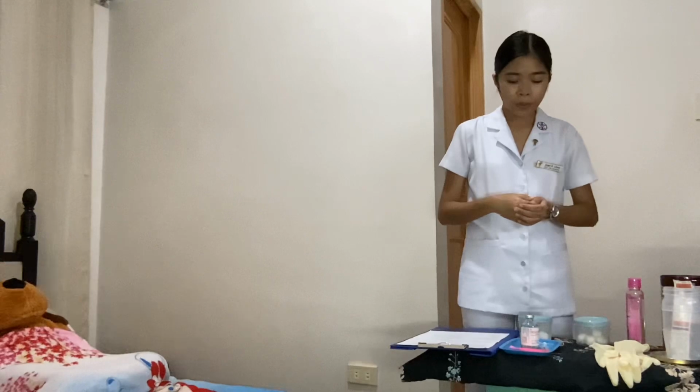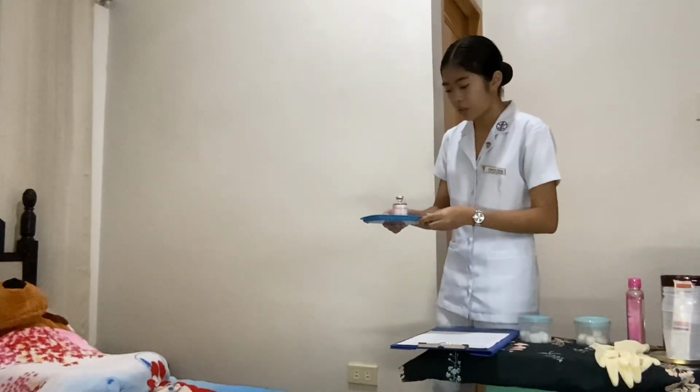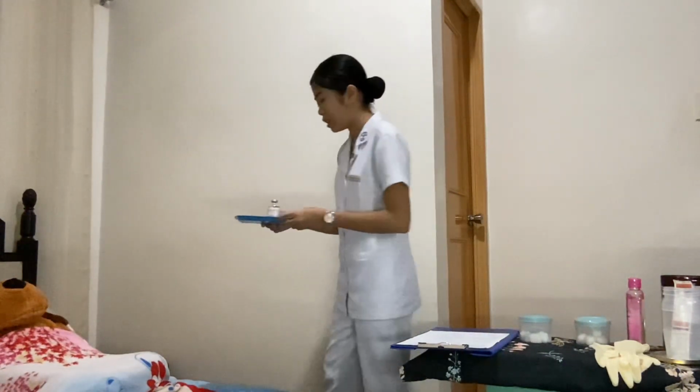Now that we have already prepared the medication, what we're going to do next is to administer the medication to our patient. So let's assume that we are standing in front of the patient's room. What we're going to do next is to knock first before entering the patient's room. So now that we're in the patient's room and now we're carrying the medication, let's first set up the bedside table of the patient.